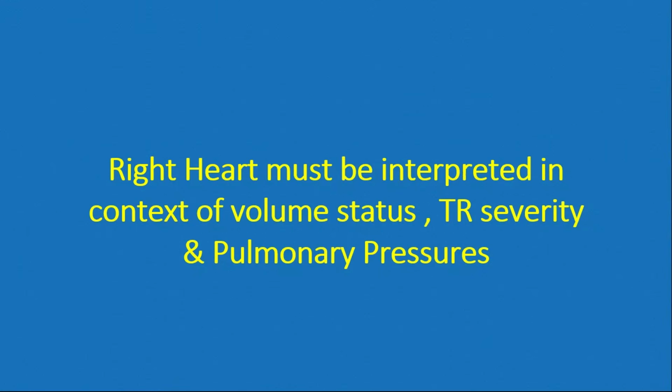So I'm telling you all this because in the next presentation, you'll be thinking, what did I get, and what am I looking for now? So again, I'm saying the context is very important. It is not just that you have diagnosed that the right heart is dilated and that's it. You need to find out why it is dilated.